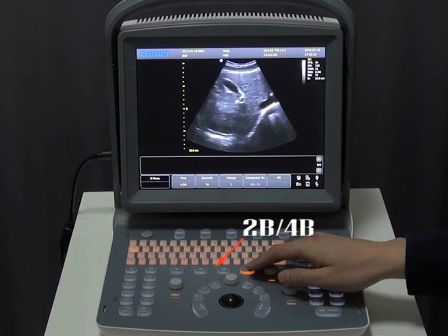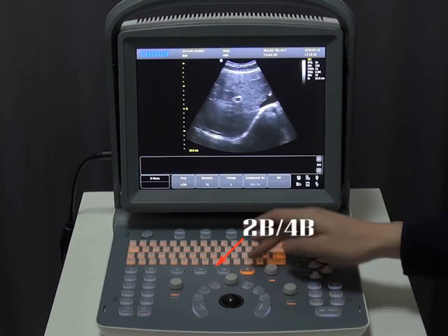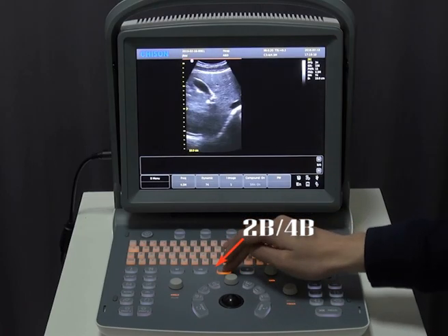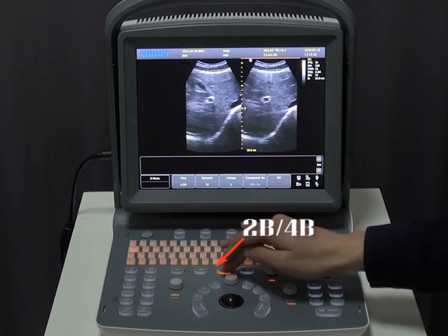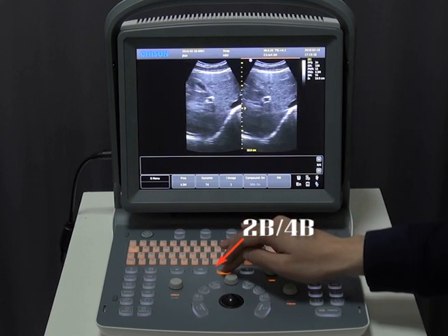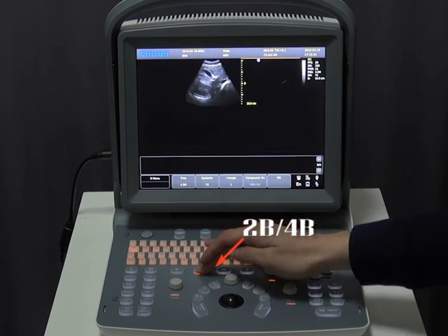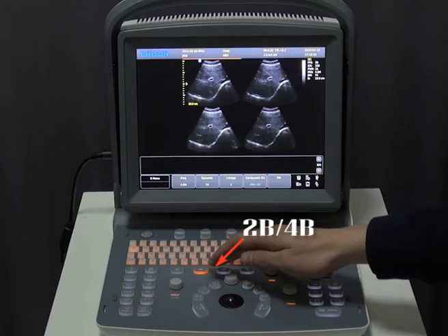We also have 2B mode and 4B mode. For example, in 2B mode, click for the first panel and get one active. Push it again and the next will become active. The same works for the quad screen.